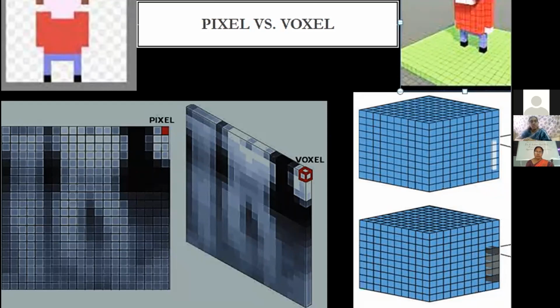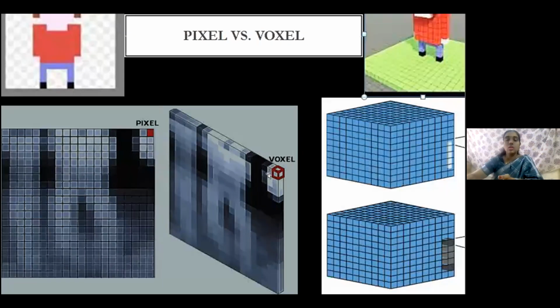So the volume reconstruction performed by the digital system is made of voxels. This is a pixel, and the third dimension of the pixel, the 3D form of the pixel, is the voxel. These voxels are known as isotropic when all the sides are equal in size.